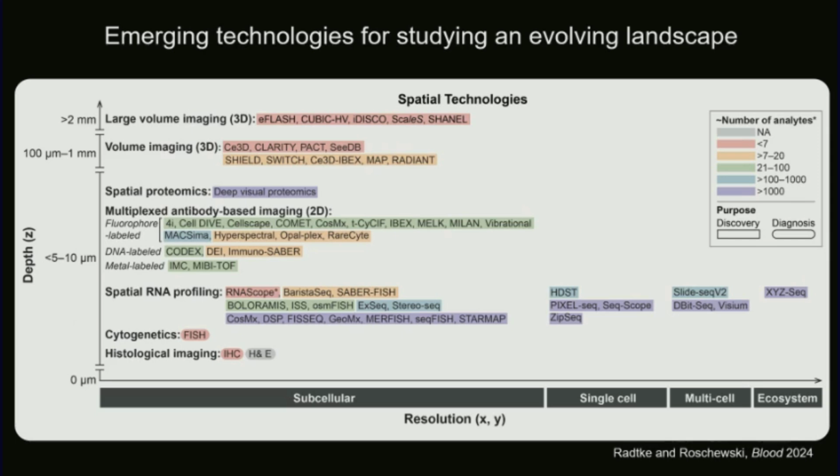And so there's a lot of methods. It's constantly changing. Where you're seeing the evolution of these methods is improvements in resolution. I think also improvements in the depth of tissue that can be imaged, but we know that we need better affinity reagents to penetrate these tissue volumes. And then also improvements in the plex and combining multi-omics. With Visium HD, now we have better resolution, if you will, with the new technology, and then also something that had been developed by Leica Microsystems, the company that I work for now, is the ability to do 15 plex in one go in thin and thick tissue samples using an advanced confocal instrument.